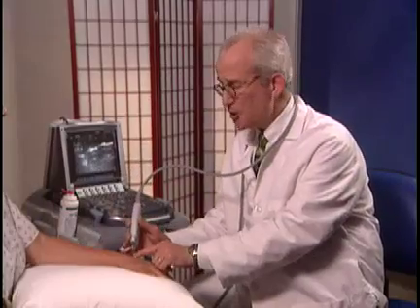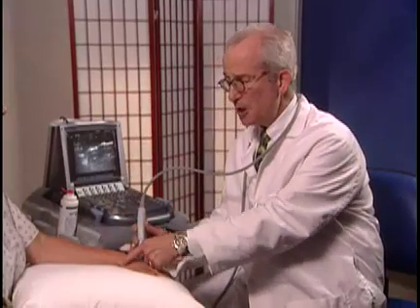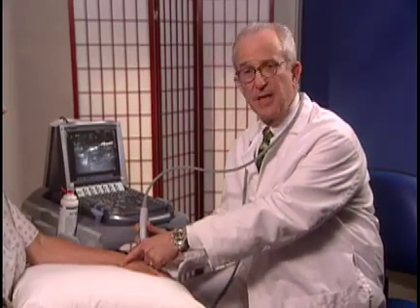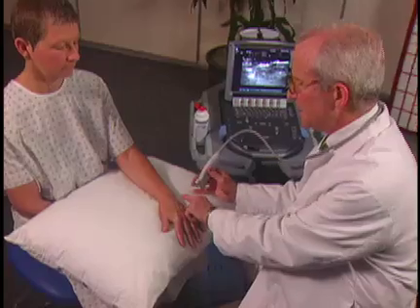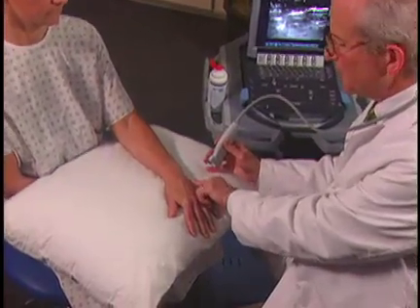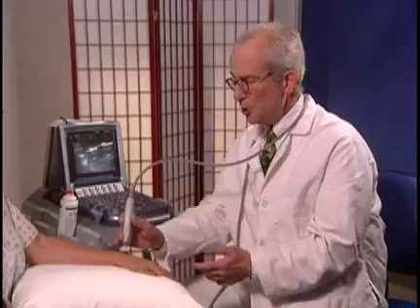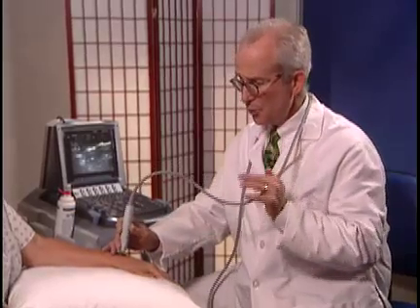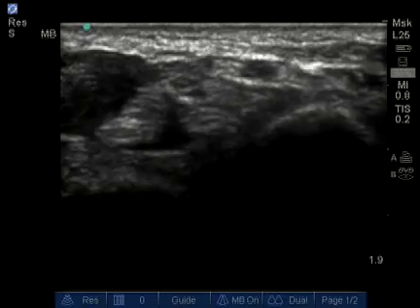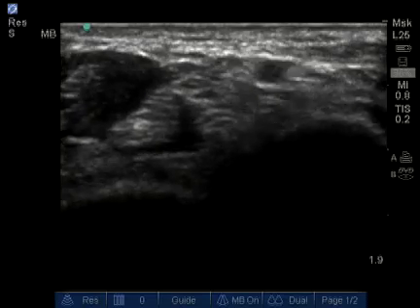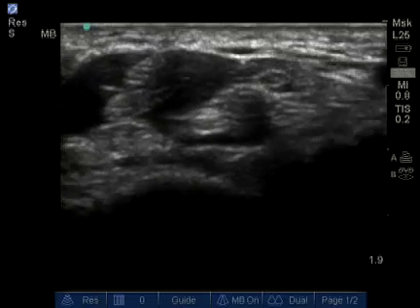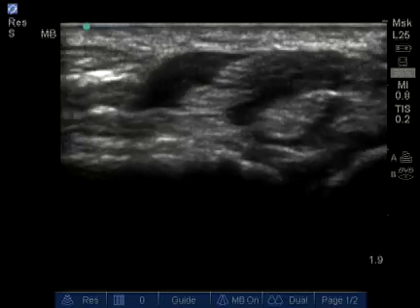There are six compartments, beginning with the first compartment at the base of the thumb and the sixth compartment near the ulnar styloid. When we look at the wrist structures, we're looking not only at tendons and bones, but also at a multitude of joints.